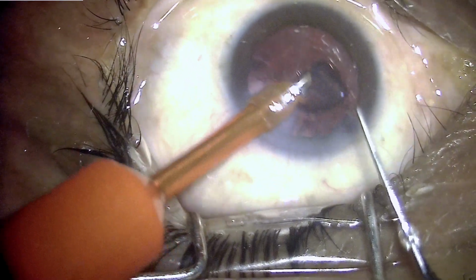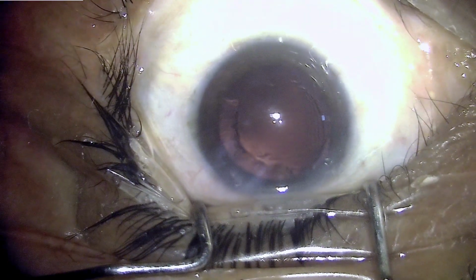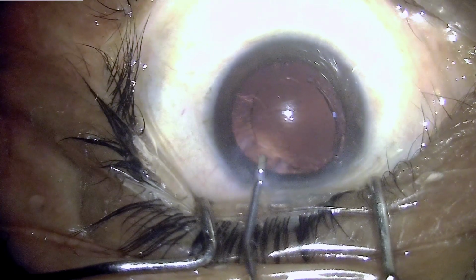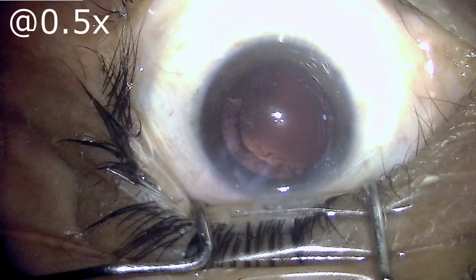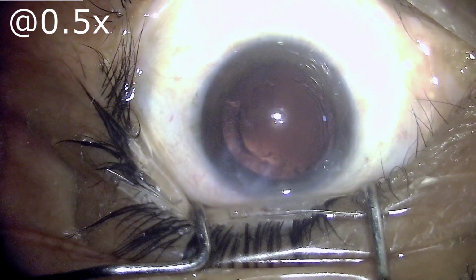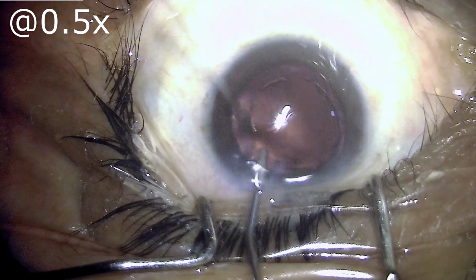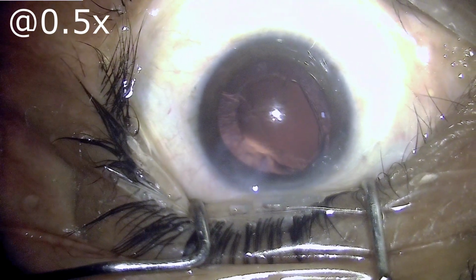And at this moment we find that everything is fine, and note what happens next. The moment I pull out the phaco tip, the anterior chamber collapses and the PC stretches, and there is a posterior capsular rupture. Let's see that in slow motion, and we can see that happening in front of our eyes, the rupture being created from one end to the other end, and viscoelastic is being injected so as to normalize the anterior chamber configuration and pressure.